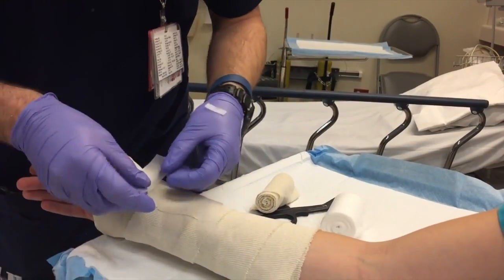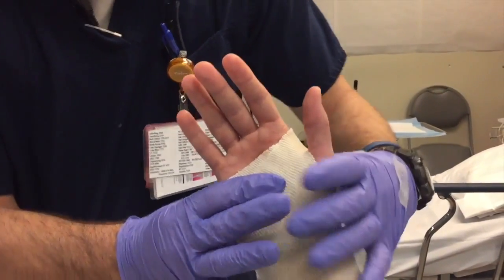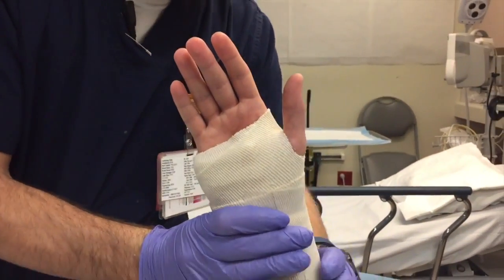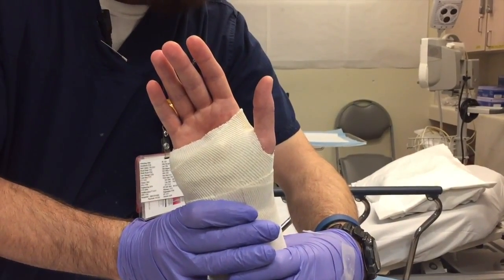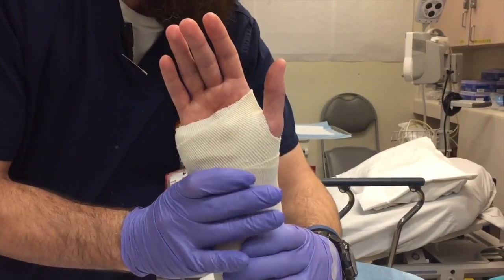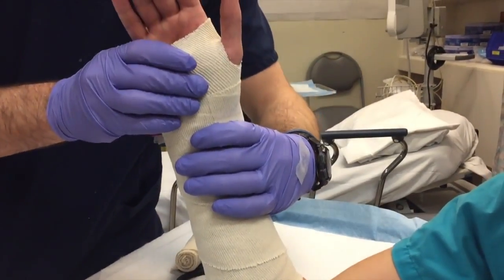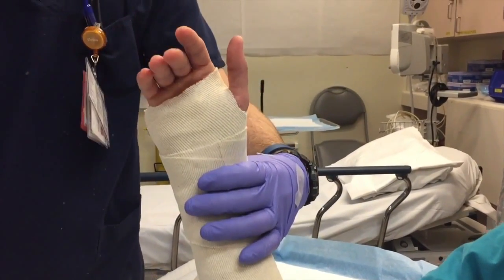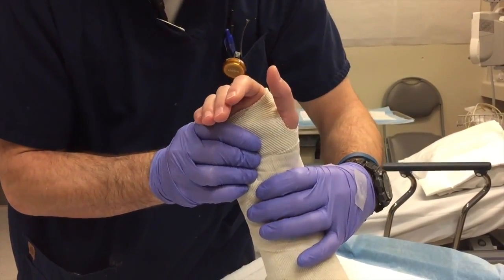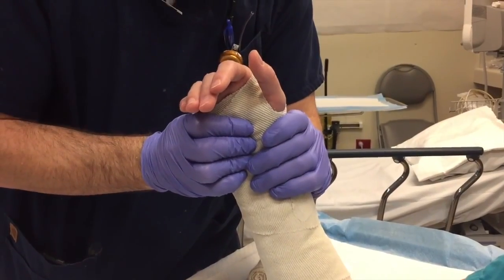All right, once again, it's a good looking splint. You can wiggle your fingers, and then we're going to check cap refill, make sure that's still good. You also want to mold the splint to the arm, to the bones, so that you get the position that you want. Depending on the case, sometimes the MDs want what they call position of function, or position of comfort, so it's bent forward a little bit. When I'm doing a splint, I always ask the MD if there are any specific instructions they want.